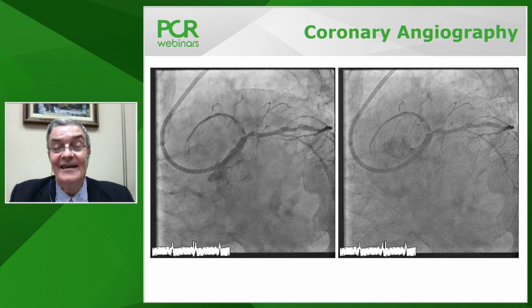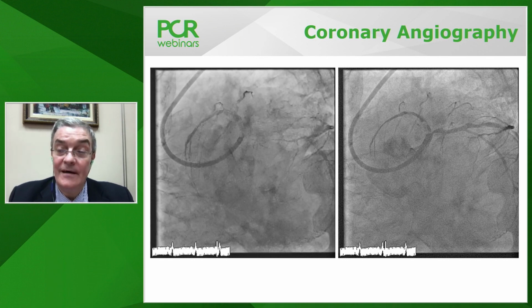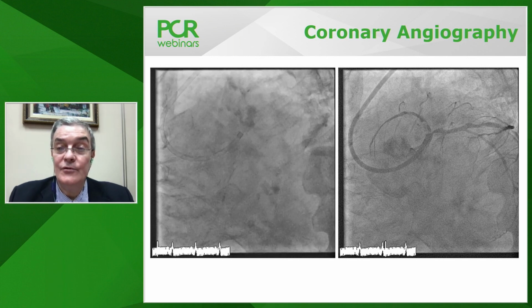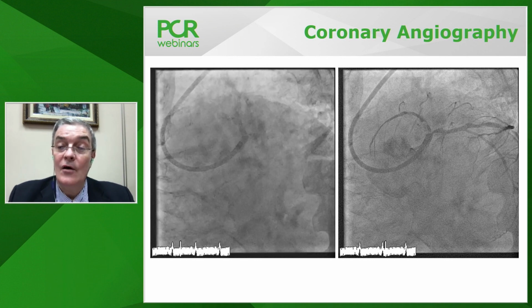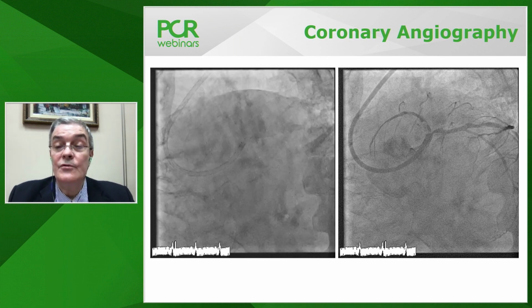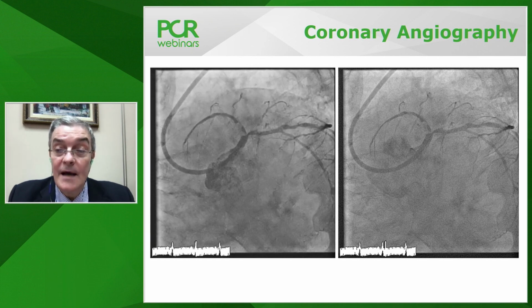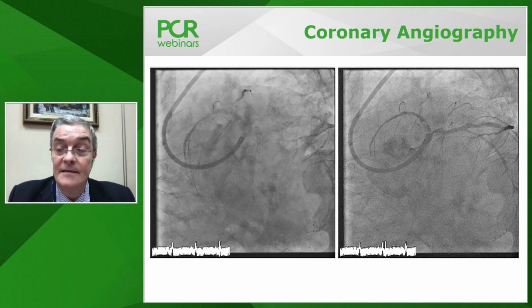Yeah, thanks. Of course, I agree completely with you. It's even easier to say the first stent goes towards the culprit, which is LAD, definitely. In this case, optimization inside the left main, recross distally, and I'm almost sure that in this case, I may stop with T or TAP, depending on the possibility to really cross through the very distal cell.